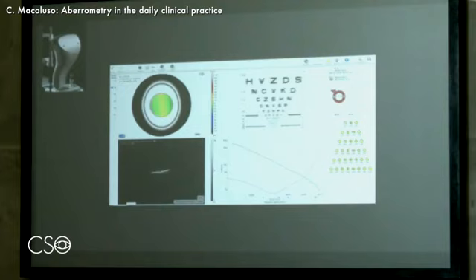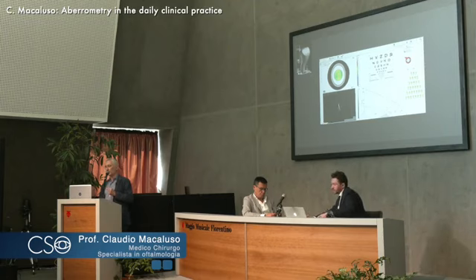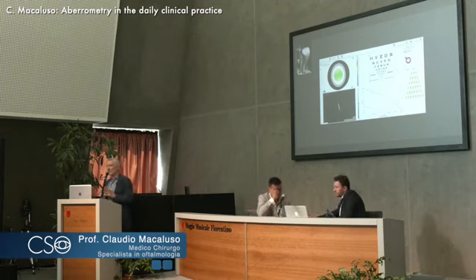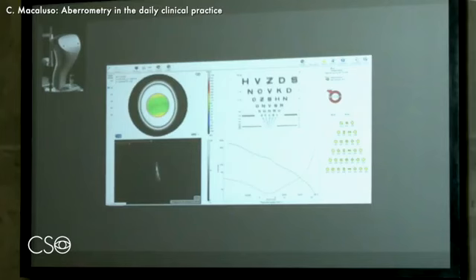All of us have studied optics and imagined how the focus lines are at the extremities of the Sturm's conoid. But here we can actually see them in the real eye of the patient. So this is one. We go to the other extremity of the Sturm's conoid, we get the perpendicular one. And this is not just something playful for us, which is nice, I like it, but also with patients it's very useful. So we can show them what is the effect on visual acuity of this distortion. And in counseling, for example, for toric IOLs, it is an extremely useful tool.